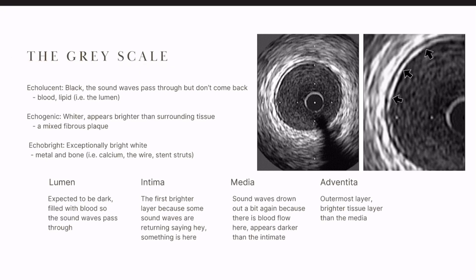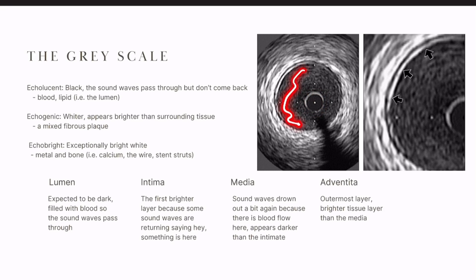The gray scale we keep talking about: echolucent, echogenic, echobright. Echolucent is equivalent to the color black. Looking at this image, the echolucent areas include the center, a thin hairline here — which is better seen here — and some black out here which we don't really worry about. Black means the sound waves either don't come back at all or come back very slowly. That is what you get with blood and lipid, which is why the lumen appears darker because there's blood in there.